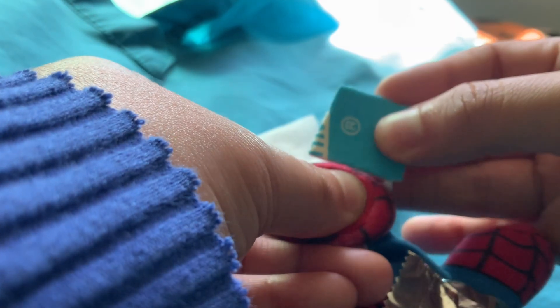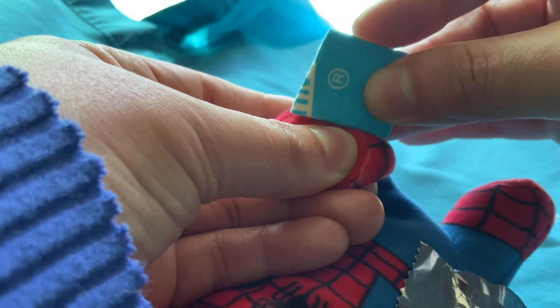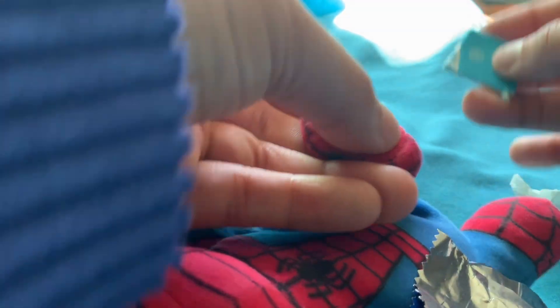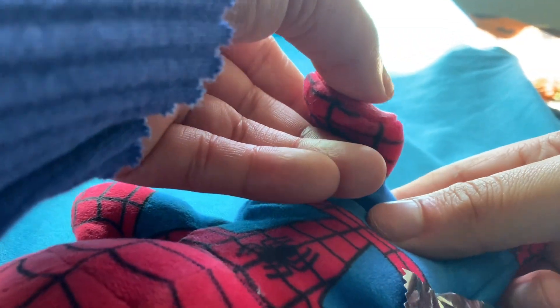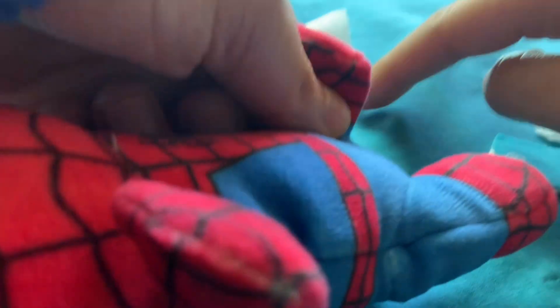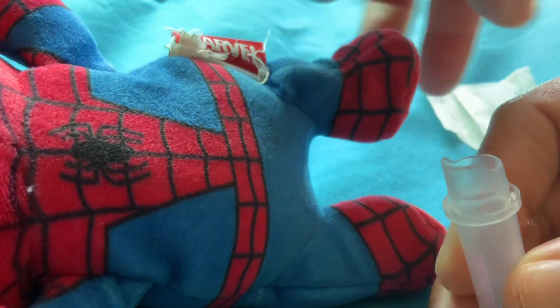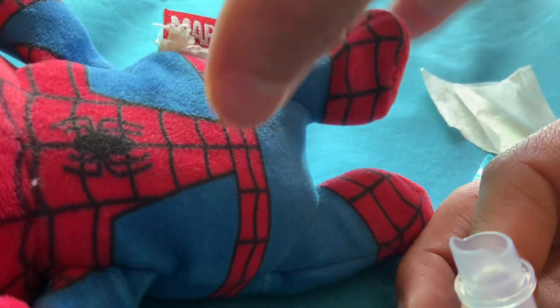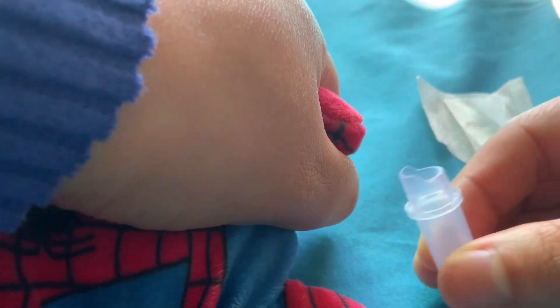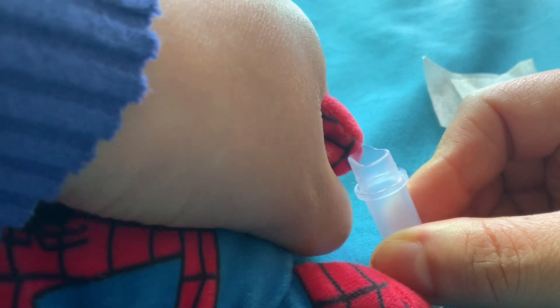I grab the lancet like this, press down, holding the heel. I press down before I actually click — that's going to give you a good flow. Once you do that, you let go of the little foot. Wipe the first drop, hold the little heel down gently. The drops should be huge because you did a great poke. All you do is squeeze and get the drop, and it falls right in.